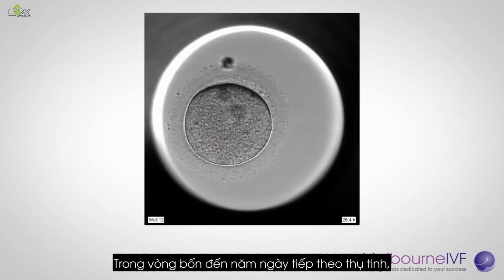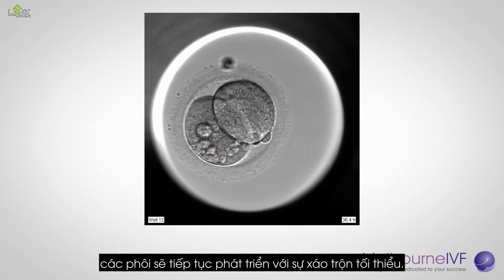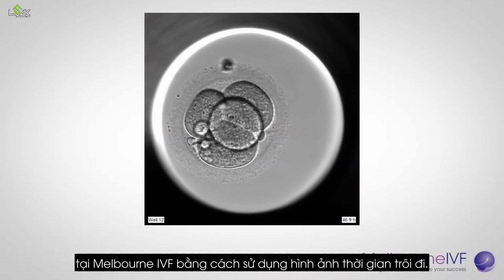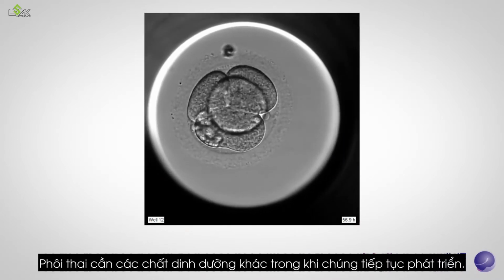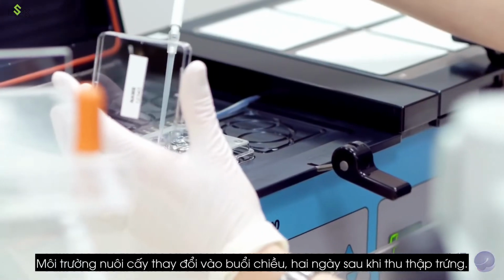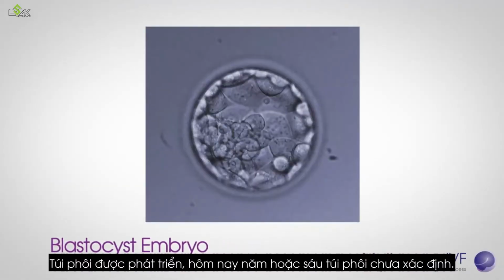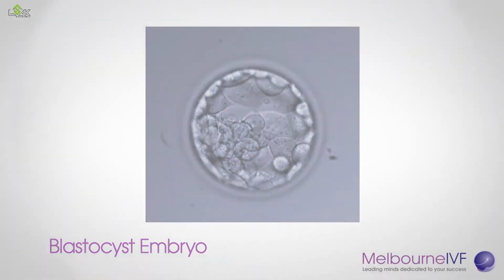Blastocyst stage transfer. Over the next 4 to 5 days after fertilization, the embryos will continue to develop with minimal disturbance. The benefit of this was highlighted by studies completed at Melbourne IVF using time-lapse images. As embryos require different nutrients whilst they continue to grow, the culture medium is changed on the afternoon 2 days after egg collection. Embryos developed to day 5 or 6 are known as blastocysts. By day 5, the embryos will have divided and may contain up to 100 cells or more.